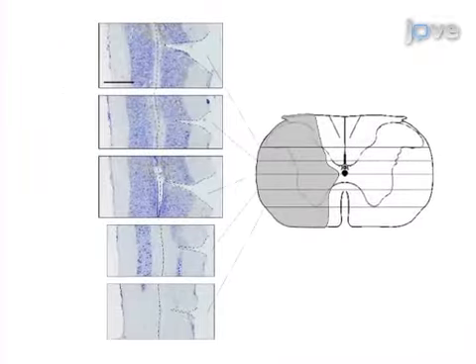Ultimately, histological techniques, as well as nerve and muscle recordings, are used to examine the extent and effects of the cervical injury. The main advantage of this technique over existing methods, such as spinal cord contusion, is that the injury is smaller and well-defined. Demonstrating the procedure will be Emilie Keomani, an engineer from my laboratory.